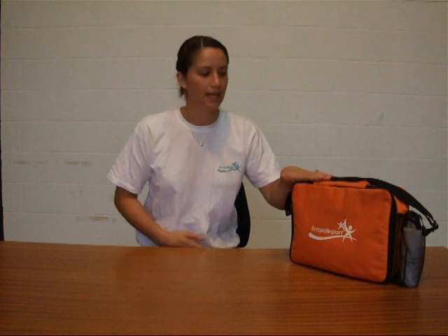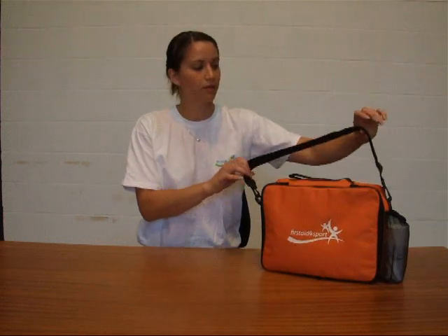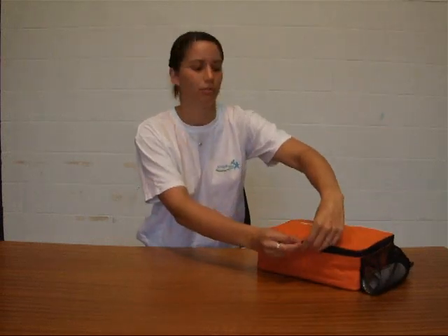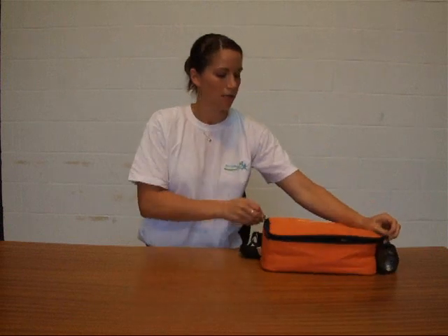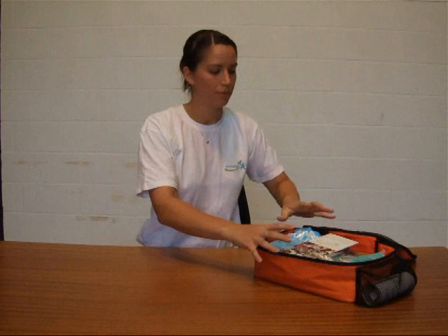Today we're going to go through some of our First Aid kits. This one is our intermediate kit. We're going to go through the bag and the contents. It's a fantastic bright orange shoulder bag with a shoulder strap. It's orange so that you can grab it from the side of the pitch easily without scrabbling around. We're going to open that up inside — we've got a fantastic pocket at the top and a big space inside.